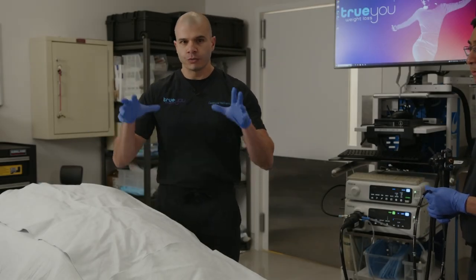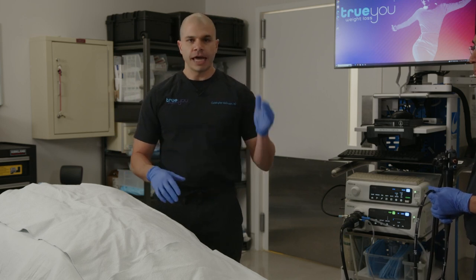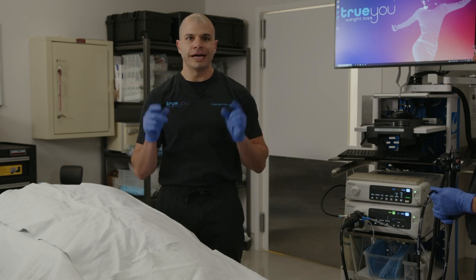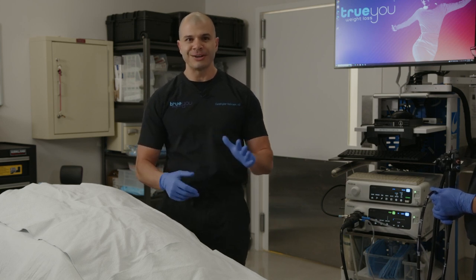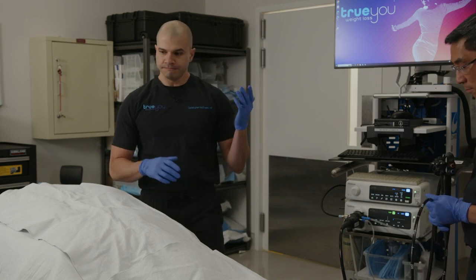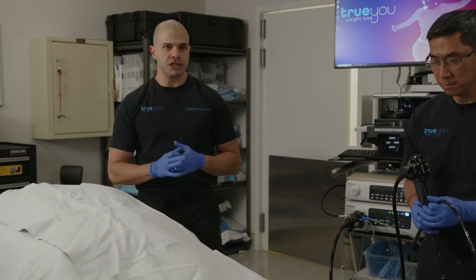We will be doing right now a live full-length endoscopic revision of a gastric bypass, also called a transoral outlet reduction or TOR procedure. So we're going to walk through the entire procedure in real time, and hopefully this will be informative, educational. A couple of things that I want to mention initially.